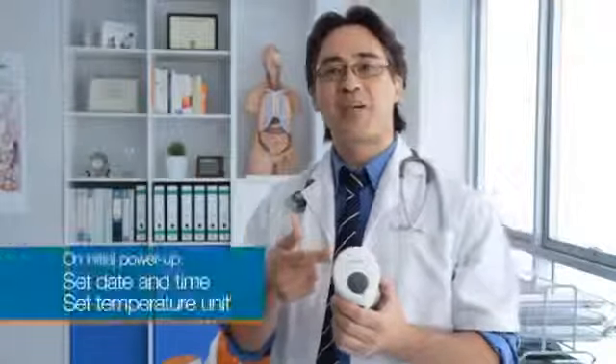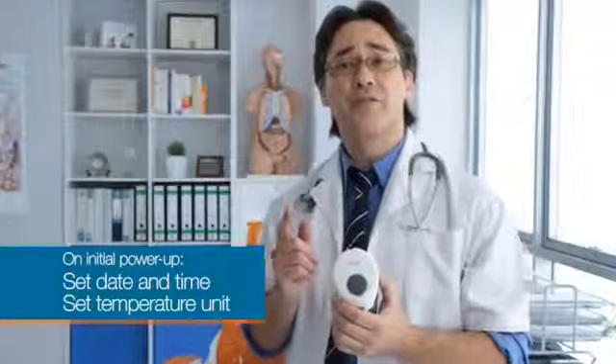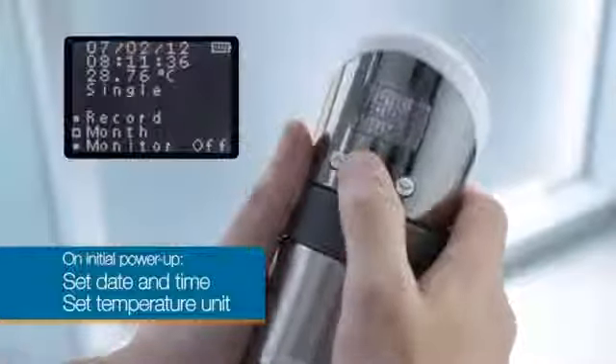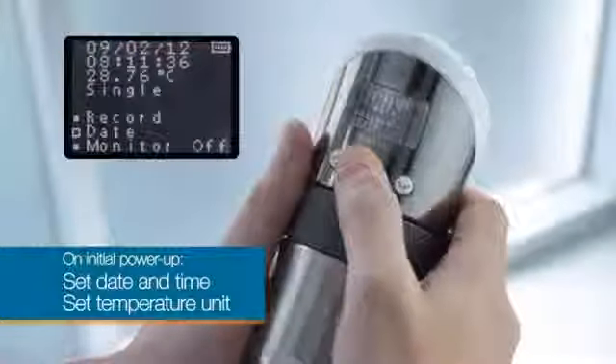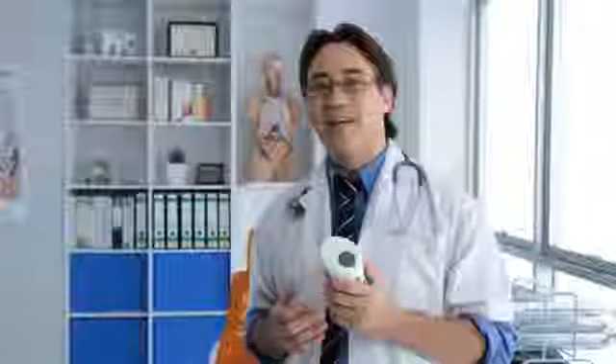The first time you start up the X-HALO, or after changing the batteries, you may need to set the date and time of the device and the temperature unit you intend to measure in. Make sure there's at least one bar of battery life left.